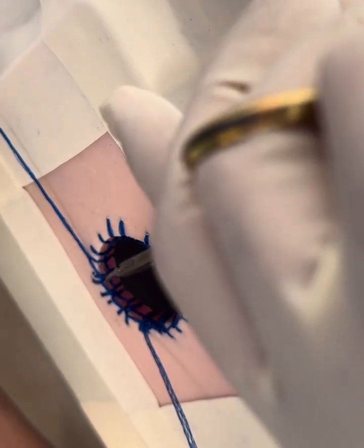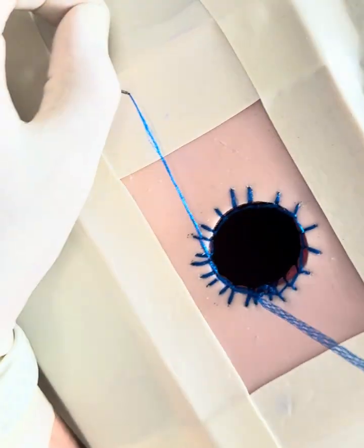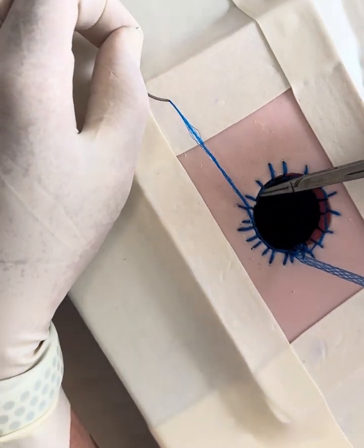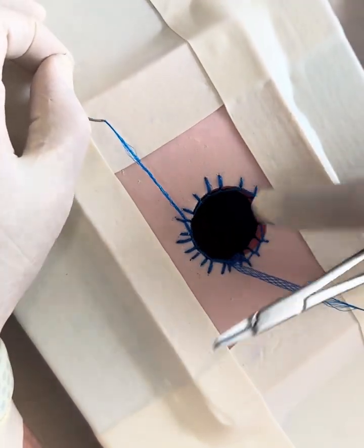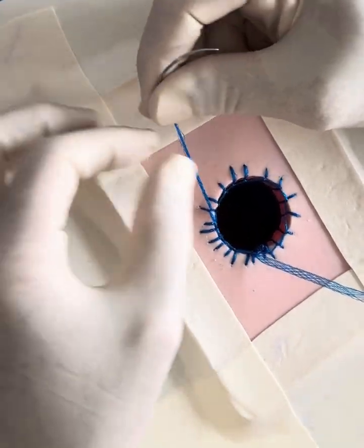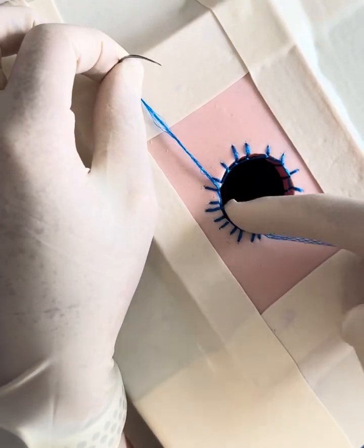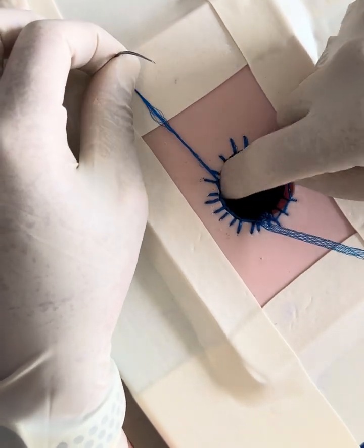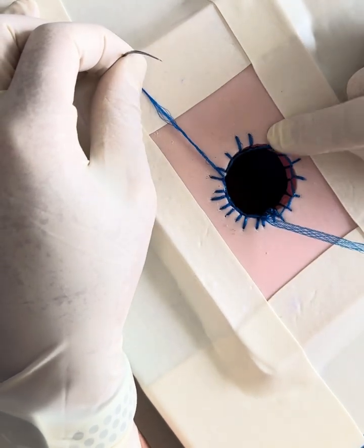And as you go, you get more and more Duramesh reinforcing the ring of tissue. There's more of it in the tissues themselves. So, and that solid ring going round. This peritonealizes incredibly quickly. We've been back into 2 patients for various other reasons who've had this done, and within 3 months you can't see the Duramesh. You can feel it, you can see the structural integrity, but it incorporates and peritonealizes perfectly.